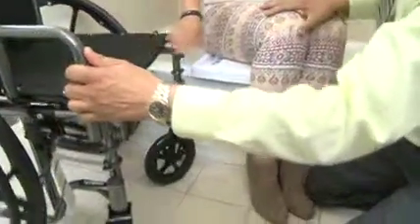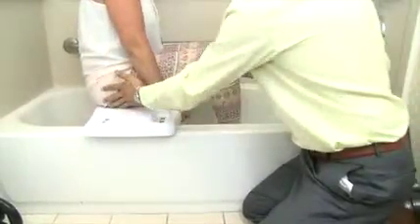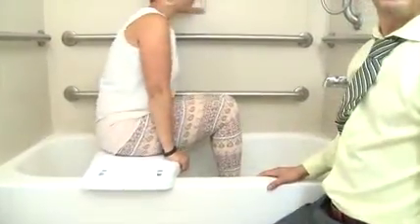Step 3. Once they are securely seated on the bathing board, carefully remove the wheelchair. Provide assistance to raise and lower their leg closest to the tub into the tub. Step 4. Provide assistance to raise and lower their other leg into the tub, positioning it next to their first leg. Assist them to continue to scoot along the bathing board, pushing down with both hands.